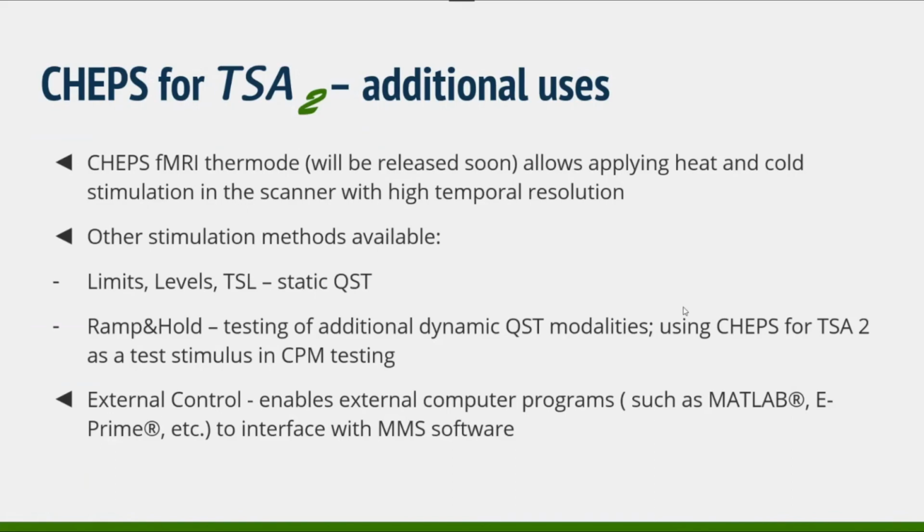I always mention that the thermode works at fast rates, but it is equally stable and precise when working at slow rates. So you can do limits or levels.